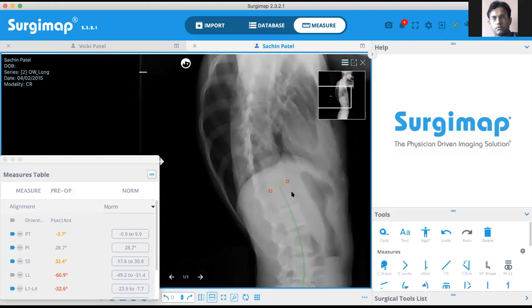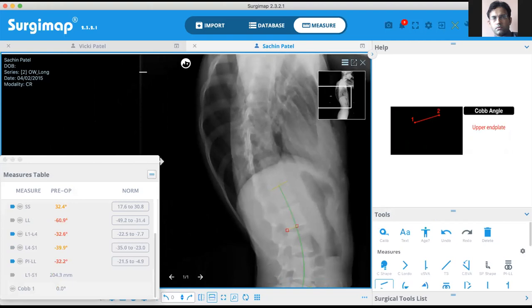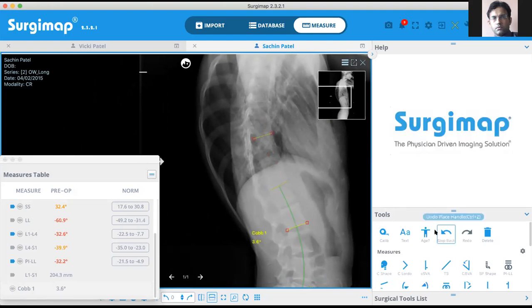So we have to choose our right vertebrae. So we take this L2 here, and see here again there is some amount of obliquity. We are not seeing them end on. Assuming this is T10, we measure that, and then it will tell us the amount of lordosis or kyphosis. So it's 3.6 over here.